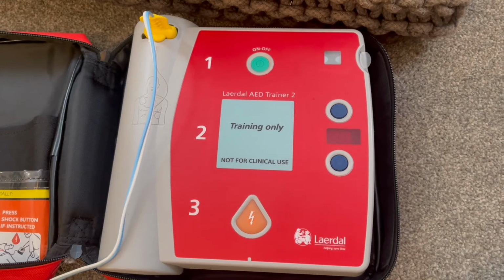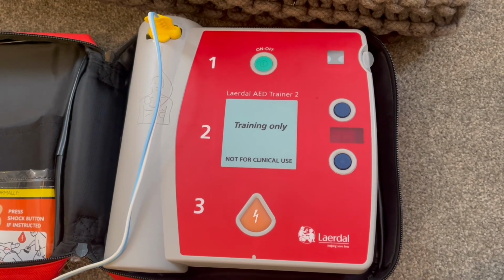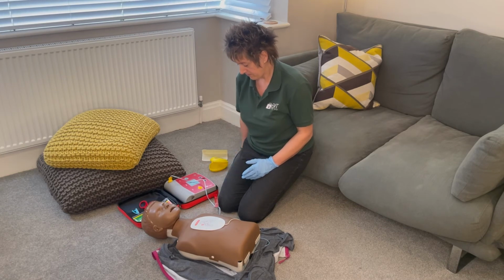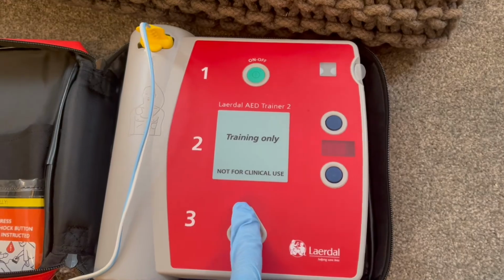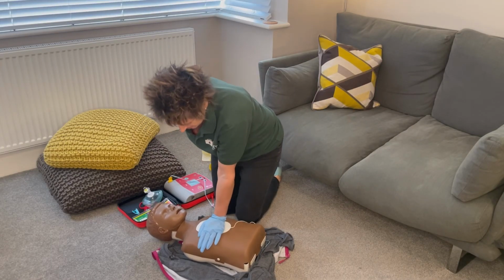Shock advised. Charging. Stay clear of patient. Now as it's charging, we're making sure everyone is standing back. We're getting ready to push that shock button when it flashes. We're then going to push that button when it tells us to. And afterwards, we're then going to carry on with our 30 compressions and 2 rescue breaths.